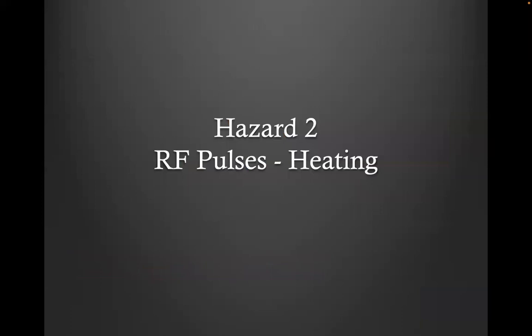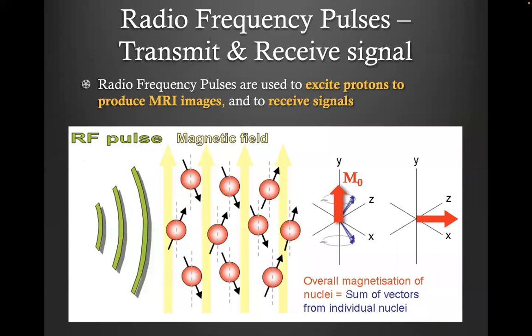Okay, we talked so much about that, but now let's move on to RF pulses and RF coils, and RF pulses, whose effect is mostly heating. We talked about RF coils, which are used to transmit and receive signals. When you do any MRI sequence, you start with RF pulses, radio frequency pulses, tuned to the Larmor frequency. Remember, at 3 Tesla it's 128 megahertz, which is in the radio frequency range. That's why we call them radio frequency pulses.